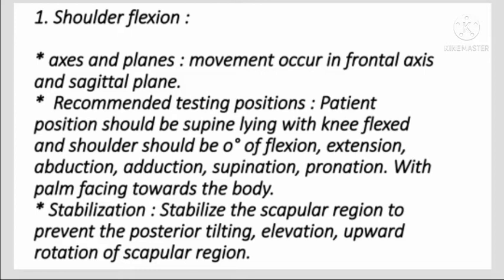Recommended testing position: the patient should be supine lying with knees flexed and the shoulder at 0 degrees of flexion, extension, abduction, adduction, supination and pronation, with the palm facing towards the body. Stabilization: stabilize the scapular region to prevent posterior tilting, elevation and upward rotation of the scapula.